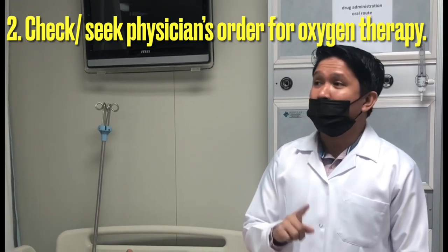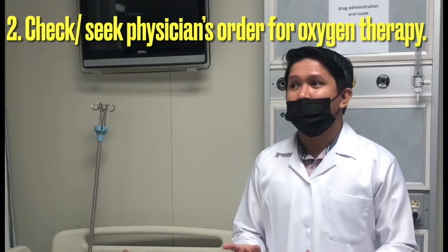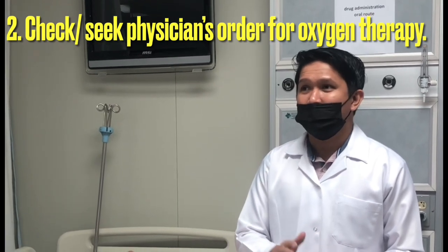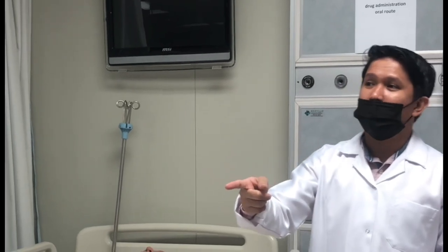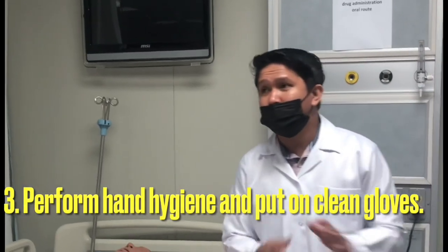Step number two: you already have the baseline data — respiratory rate, breath sounds, and signs and symptoms of dyspnea. The next thing you have to do is check for a physician order. If there is no physician order, refer the abnormalities to the physician. For example: 'Doctor, good morning. I checked my patient; he is having difficulty breathing, his oxygen saturation is 90%, and his respiratory rate is 30 breaths per minute. Facilitate oxygen therapy via nasal cannula, regulated at 3 liters per minute.'